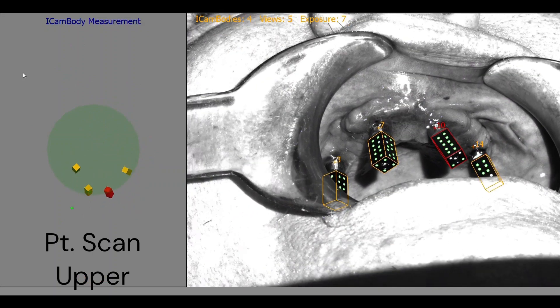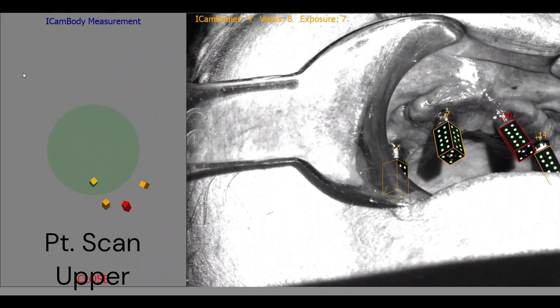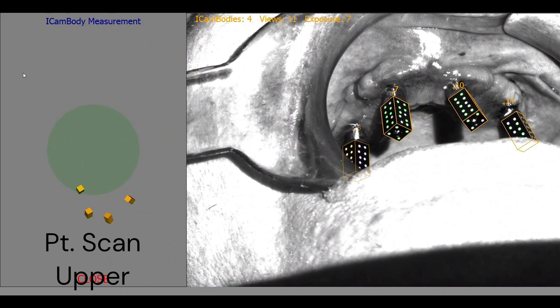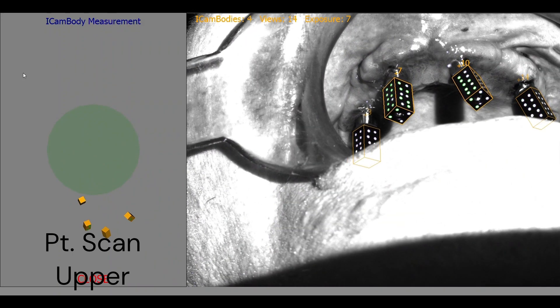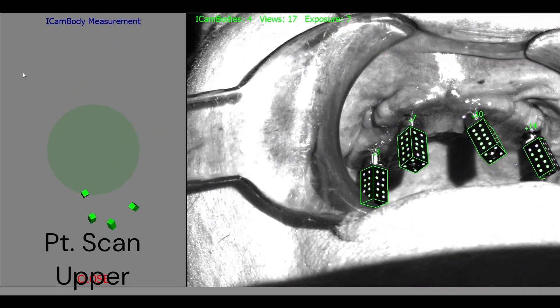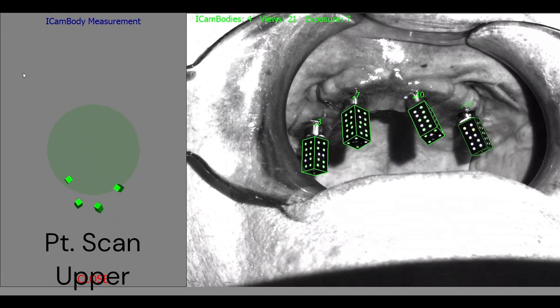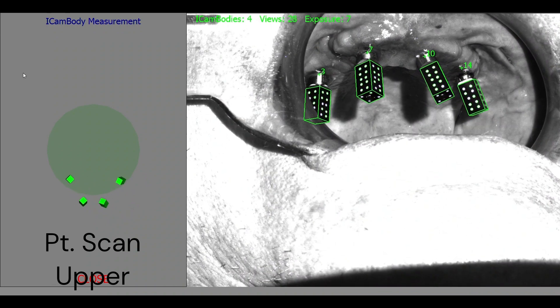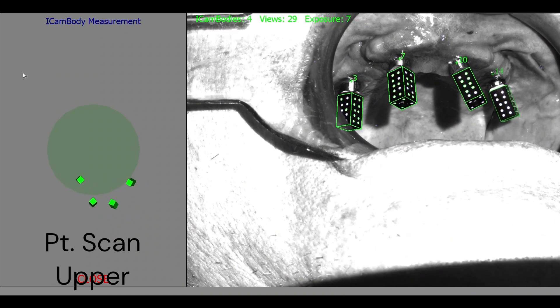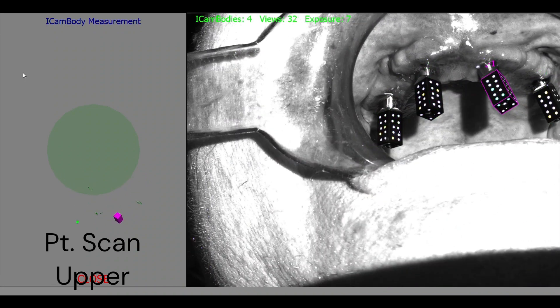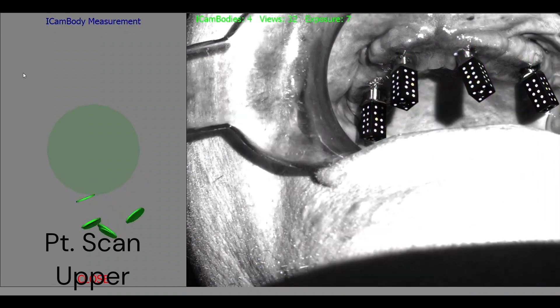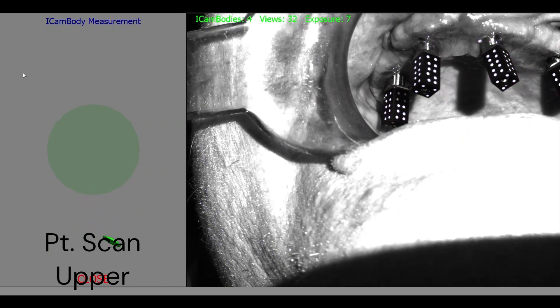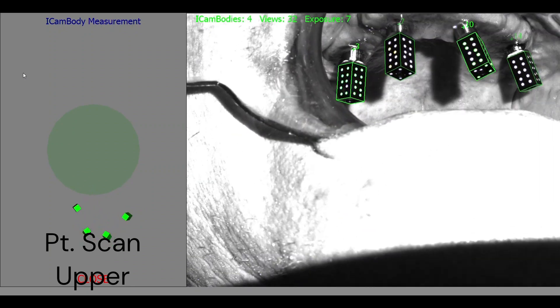Perfect. Those are the sounds we want to hear. Good, good. All right, 28, 30. Yep, looking great. A little bit further back.